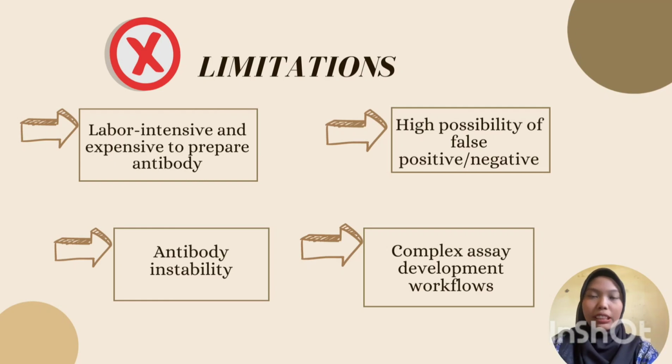There are some limitations in ELISA techniques, such as being labor intensive and expensive to prepare antibody, because sophisticated technique and expensive culture media are required. Second is a high possibility of false positive or negative result. This is due to insufficient blocking of immobilized antigen.